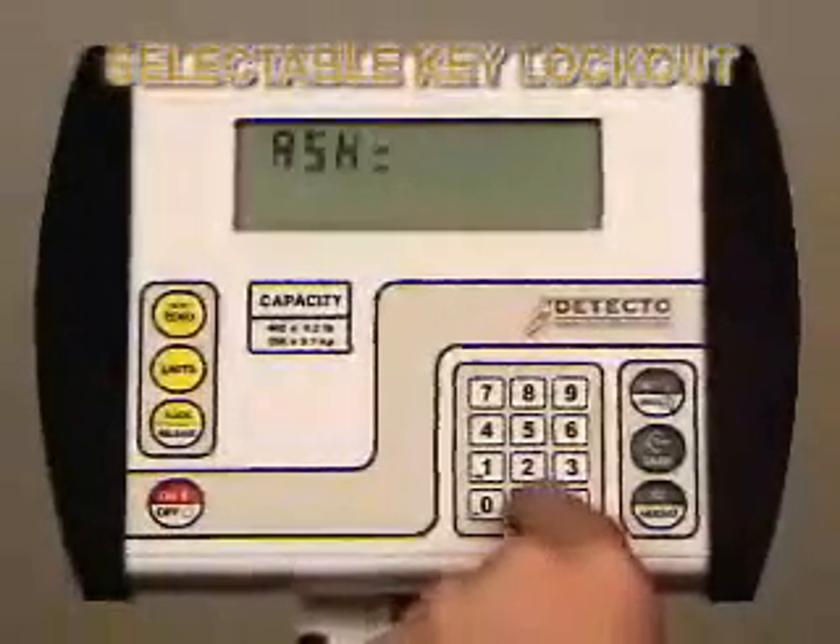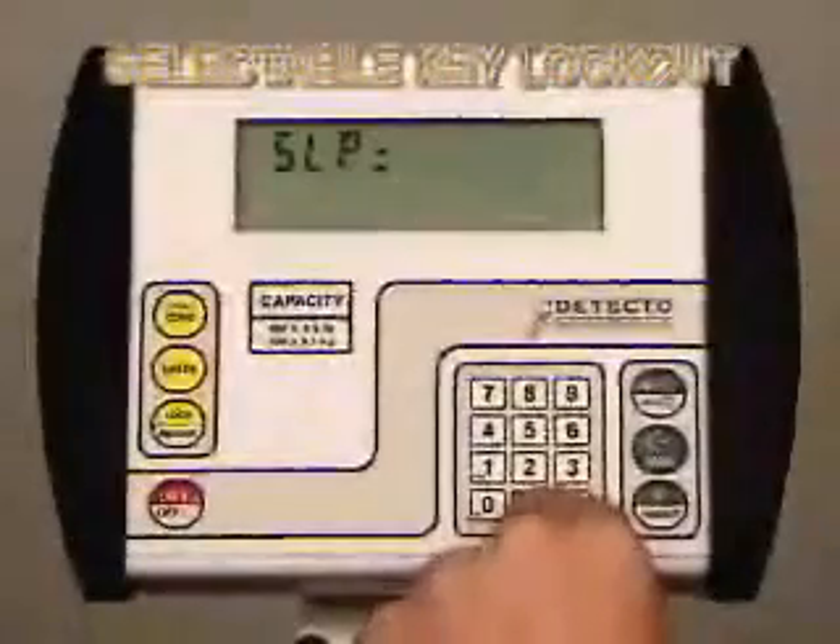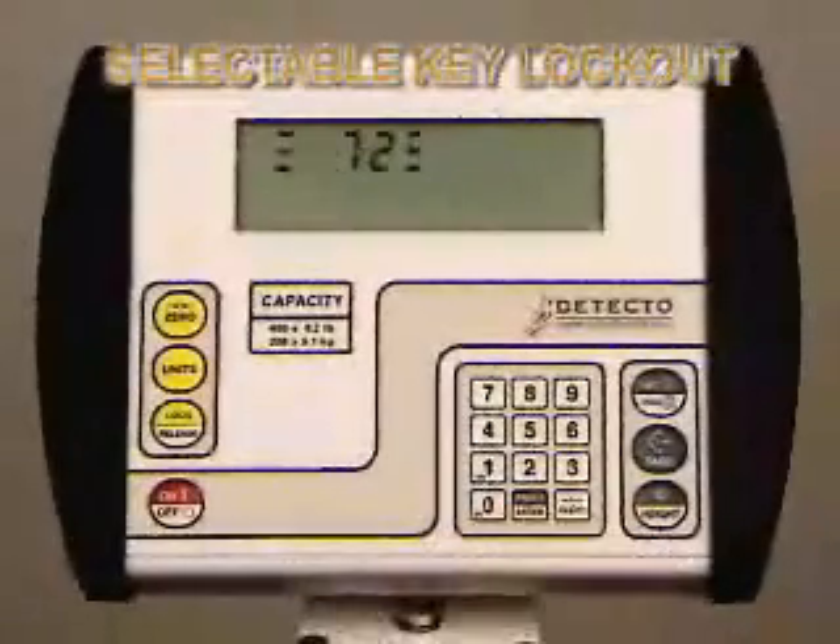Allowable values are 0, 1, 2, or 3. In this case, we have entered 1 and are disabling the Net, Gross, and Tear keys.